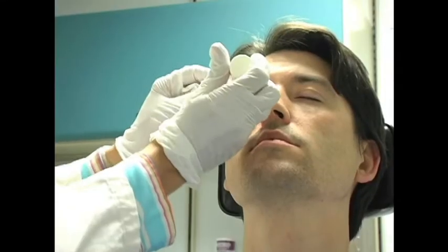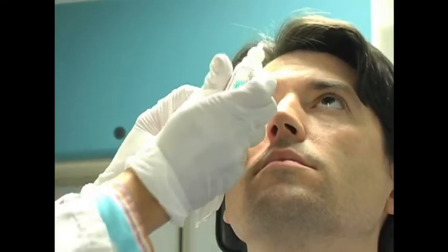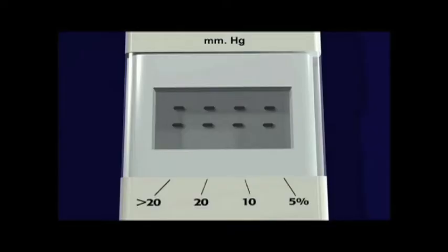First, administer topical anesthetic to the cornea. The patient should be relaxed and seated upright or lying down flat prior to beginning. Tight shirt collar should be loosened. To measure the IOP, press the operator button once. Two lines should appear on the LCD screen.